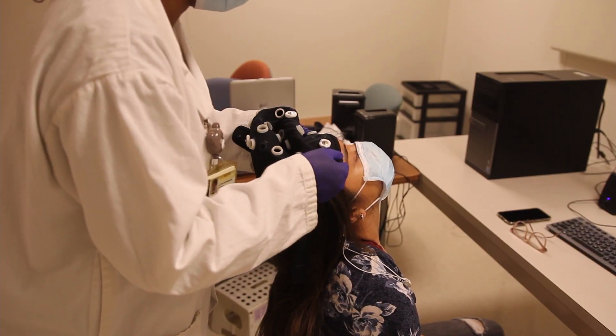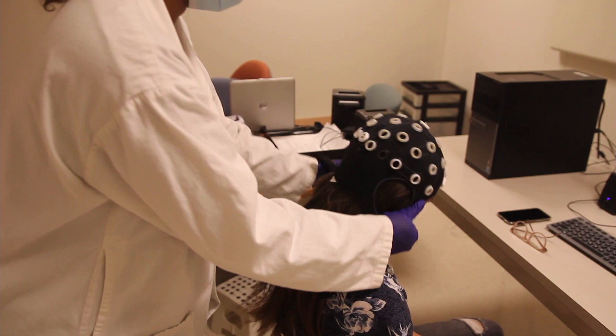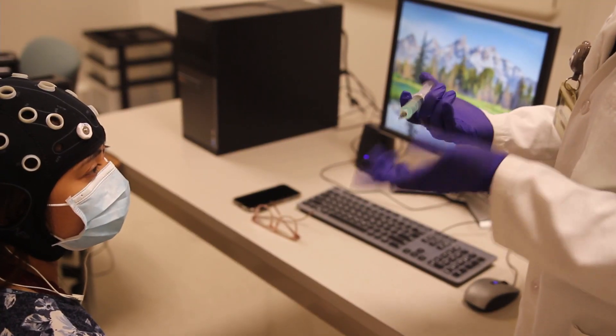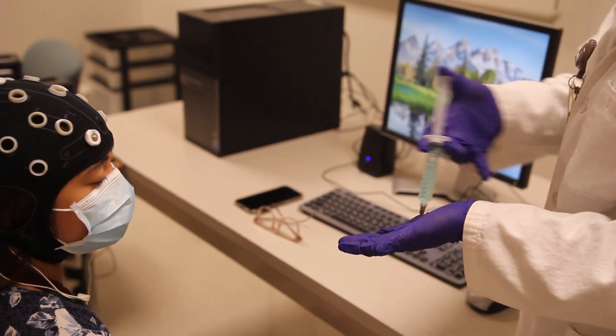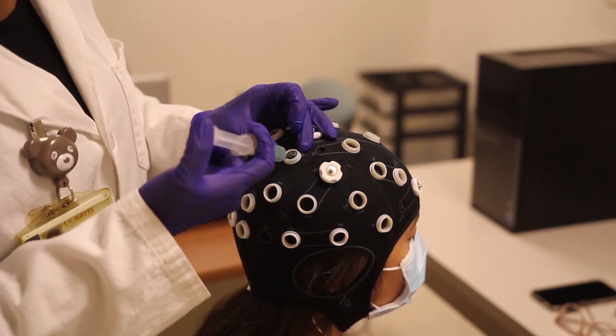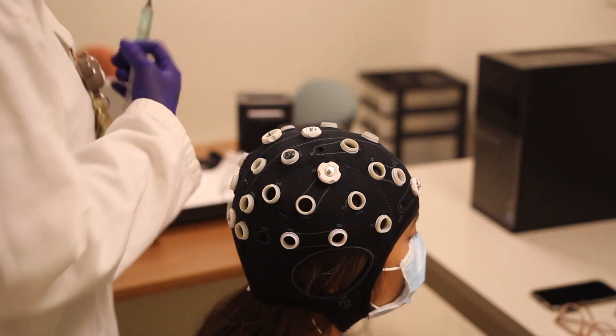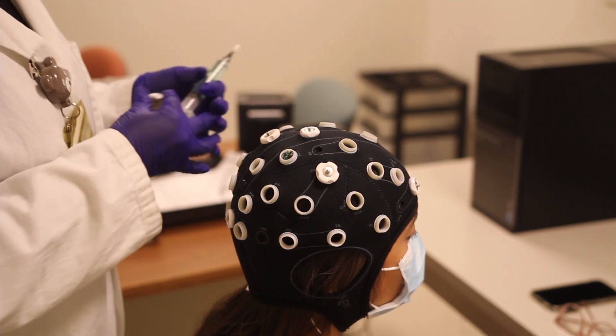Once the cap is placed on your head, we will fill each of the ports using a blunt-tipped applicator filled with water-based gel. When applying the gel, we will use a circular motion to make sure the gel is applied directly to your scalp, and then once filled, we will place the sensors on the cap.